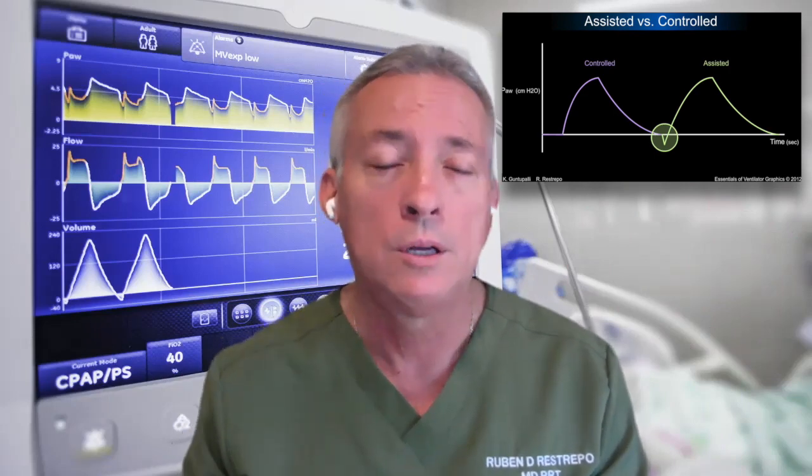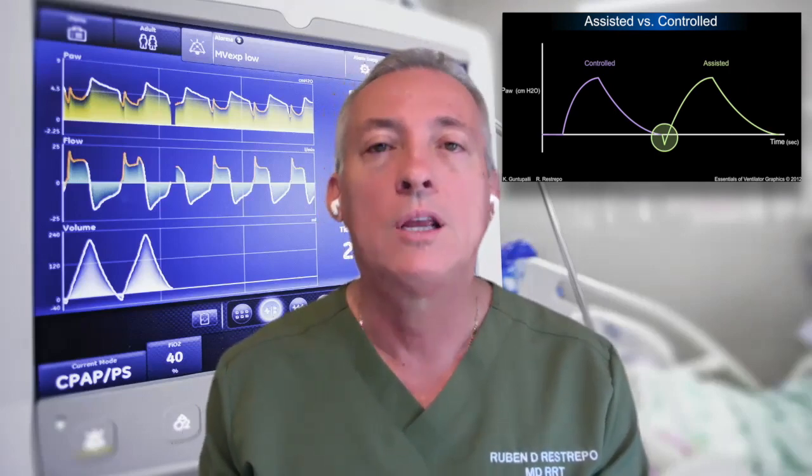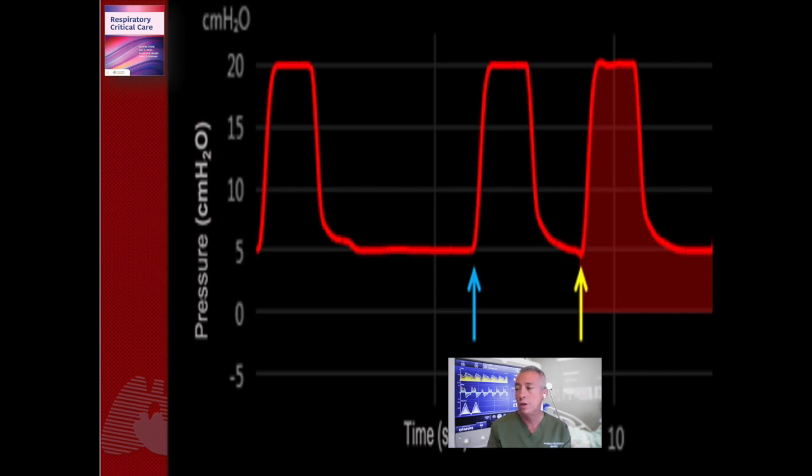You have learned from the mechanical ventilation course that if there's no negative deflection prior to the breath, it is quite possible the patient is not generating the breath. So not only is the patient not making an effort, but the ventilator seems to be reading all of them as spontaneous breaths, and in fact you don't see a negative deflection at the initiation of the breath.